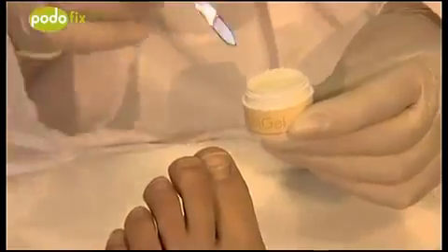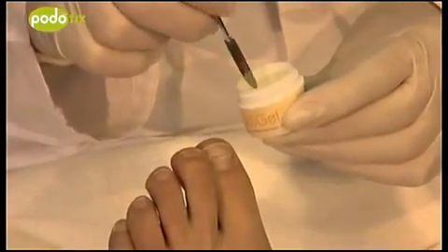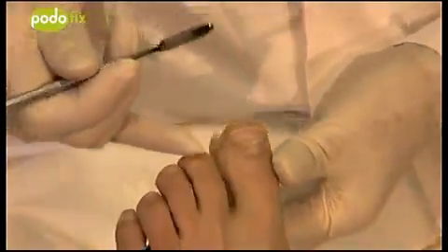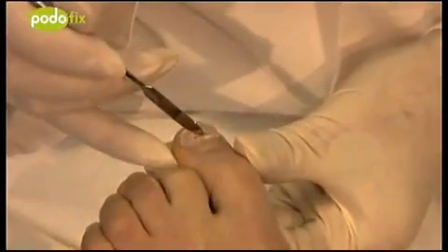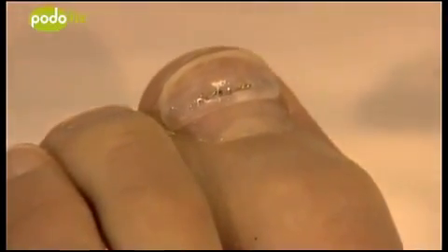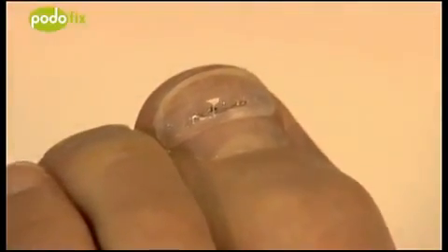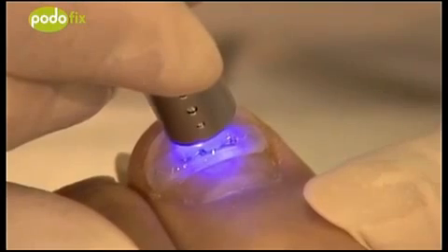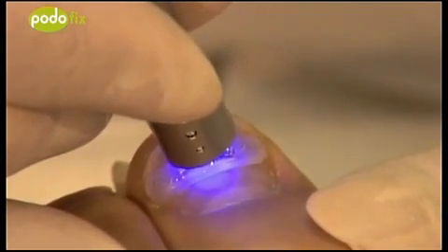To seal the PODOFIX brace, use the spatula to place a drop of pedigel on and apply it into the recess of the brace. Activate the 3TO microlamp and harden the pedigel by lighting it for 20 seconds. In doing so, hold the microlamp at the smallest distance possible from the area to be sealed.